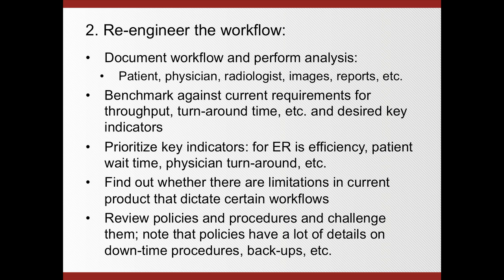So you want to benchmark it against requirements for, of course, throughput. What are your requirements for that? Throughput maybe for a procedure, throughput for a visit, or a throughput for a patient stay. Then you also want to look at turnaround time and some other desired key indicators. And the key indicator might be, who knows, cost, efficiency, personnel, things like that. So whatever the key indicators are.